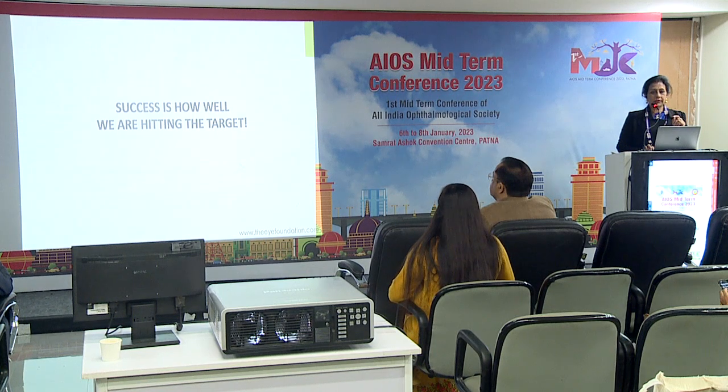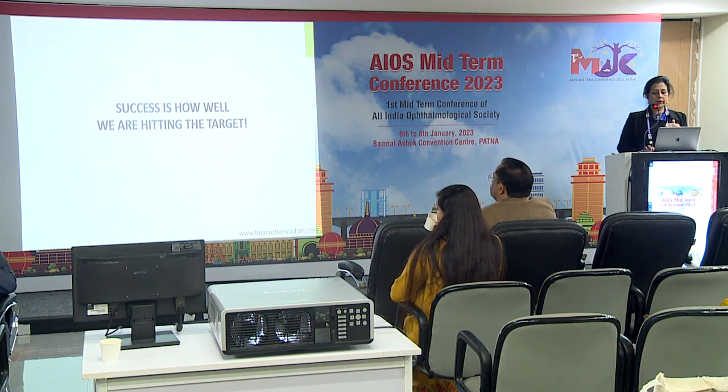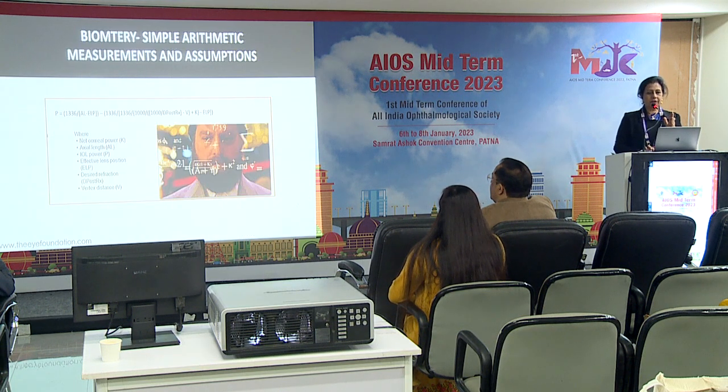Now the success in a surgery is whether you are within plus minus 0.5 diopter of the target emmetropia. And actually, if we realize that if we are not, then if we accept it as a failure, that is when we are going to be geared to give this kind of success to our patients. Biometry is actually just a simple arithmetic with measurements and assumptions.